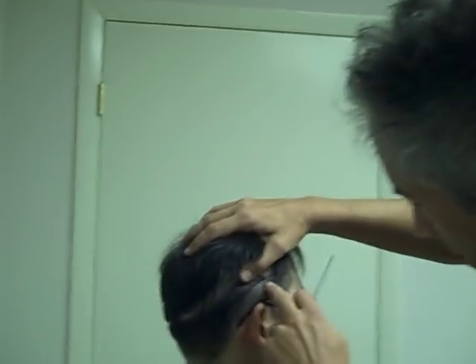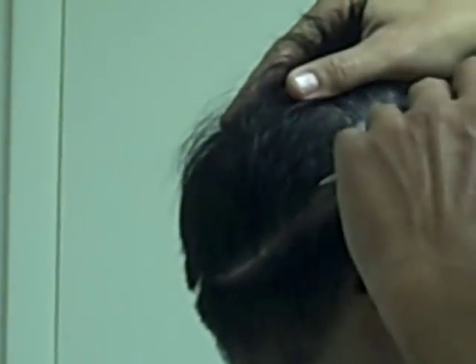To get as many grafts on this patient as possible, in addition to doing the strip, you can see I've marked out these areas, these blue lines. This represents an area where we're actually going to do FUE grafts as well, or follicular unit extraction. So we're going to remove the strip, and then using parts of the scalp, the donor area, which is good hair that's not included in the donor strip, both above and below the actual donor site incision, we're going to be doing follicular unit extraction, 0.8 millimeters, to extract individual follicles.